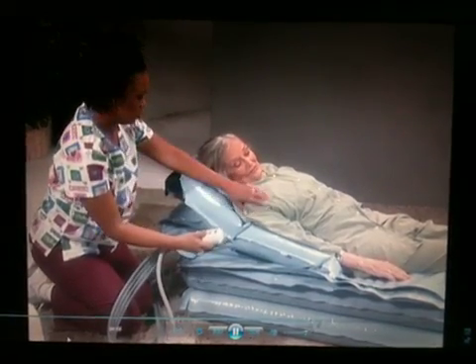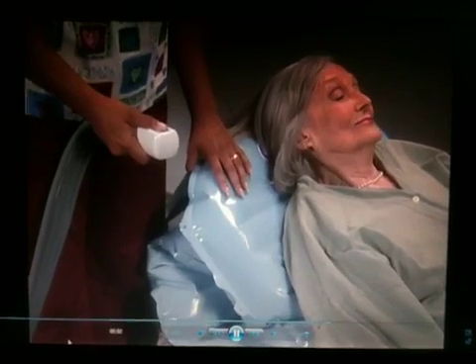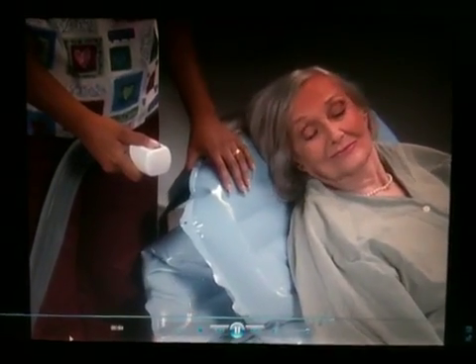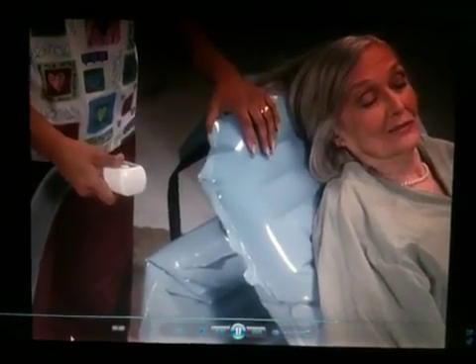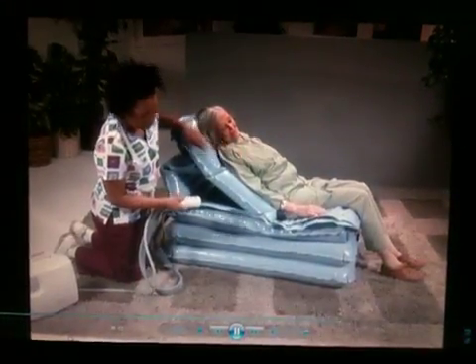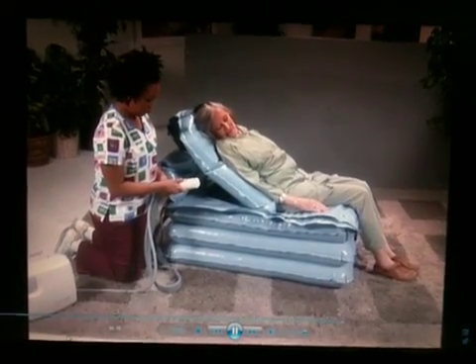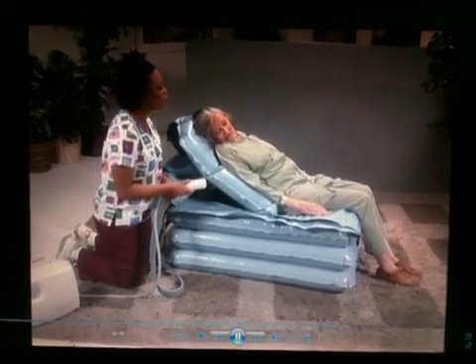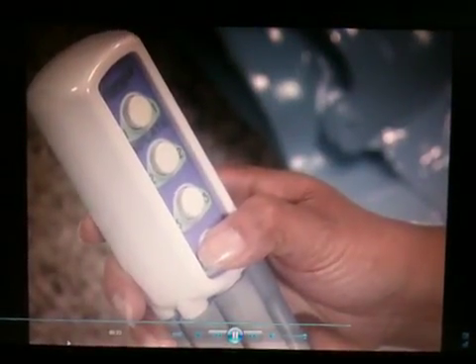Overinflation is impossible. After section 2 is inflated, the caregiver should return to the back support section to make sure the person is still supported properly. Now, button 3 is pressed until this section is completely inflated. At this point, many people won't need section 4 to be inflated to stand safely. However, for taller people, section 4 should be fully inflated.